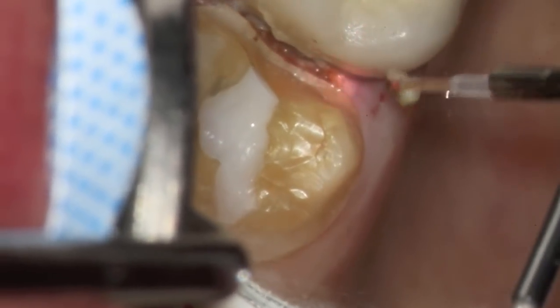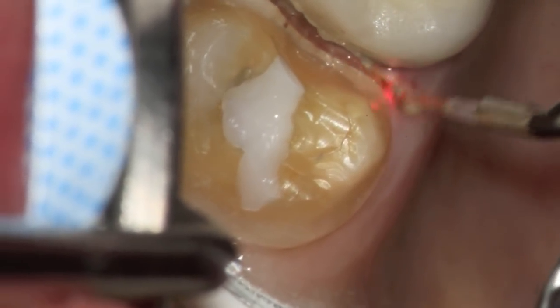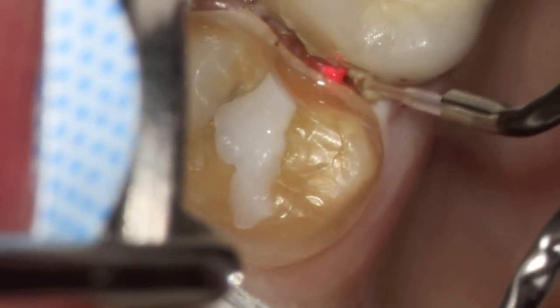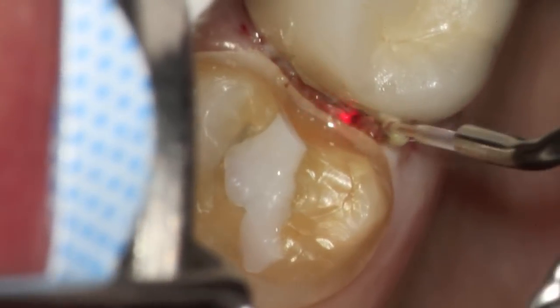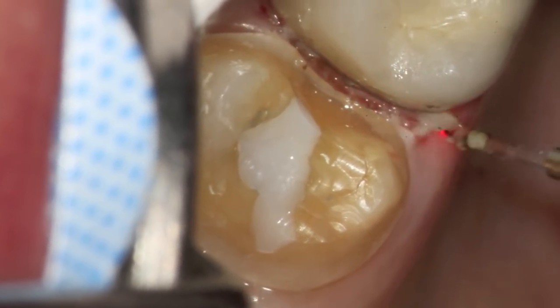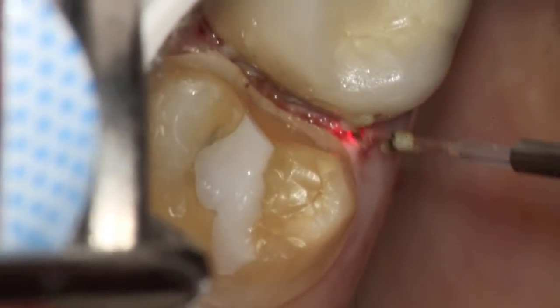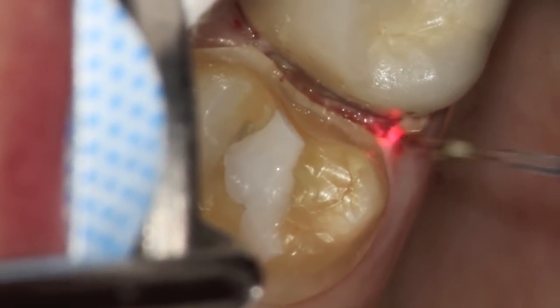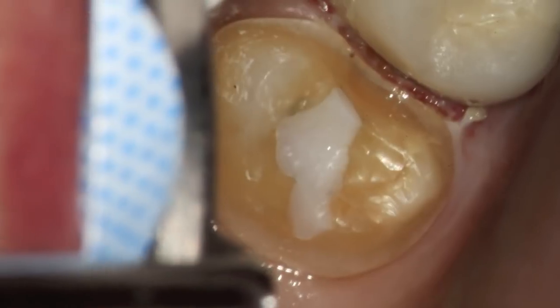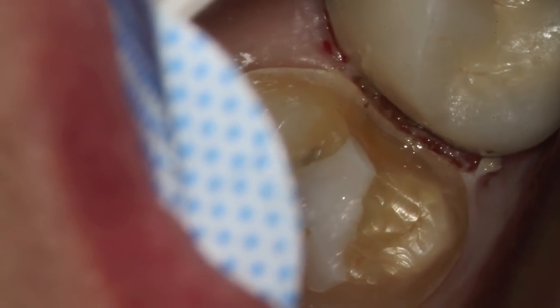Notice that there is no bleeding. This is set at 2.3 watts, and the healing time for the patient is truly remarkable. There's virtually no pain whatsoever. The dentist is able to remove the tissue and be able to see where the end of the tooth is, which is really the critical junction for any crown restoration.